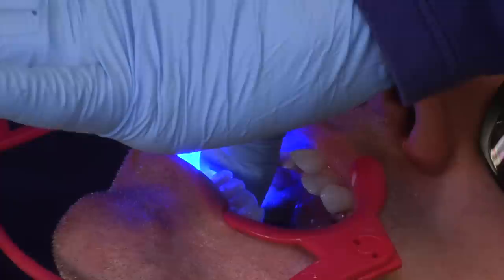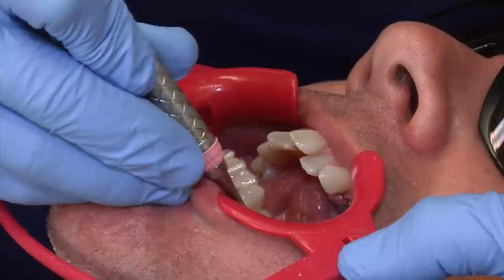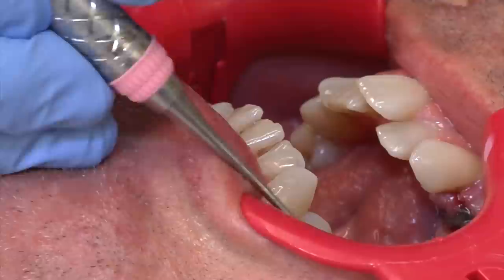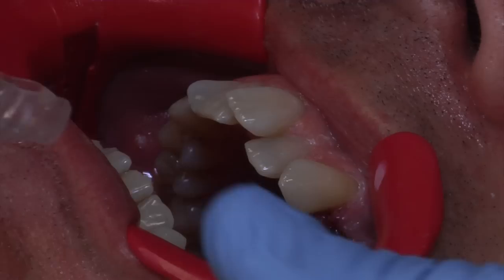We'll give each tooth a 10-second cure. Once all the glue has been hardened, we're going to remove the tray — we're going to lift it up gently, just feel a little bit of pressure, and remove it. As you can see, the tooth-colored bumps are now on the teeth. There's a little bit of extra glue — we call that flash — and I'm just going to lightly take the instrument and clean up a little bit around there.